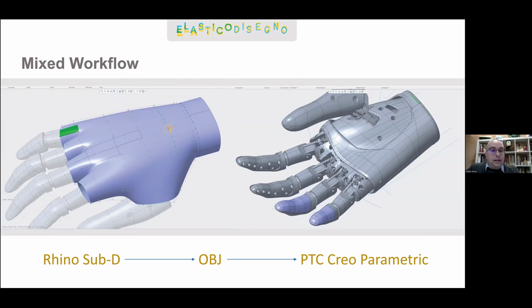Working with sub-D modeling meant that we didn't have to start from scratch in Creo after all the modeling we did in Rhino. Using an OBJ as a translation format, we were able to export all the sub-D geometry from Rhino and import it into Creo, which has a feature called Freestyle, which can import OBJ meshes and sees them as native Creo geometry. So we were able to carry over all we did in Rhino as a matter of modeling, and retain it within Creo and use it for further development.